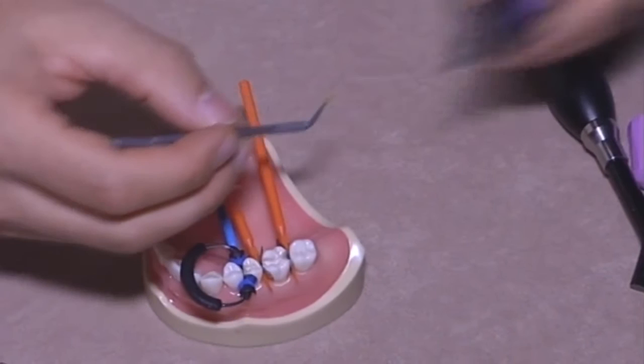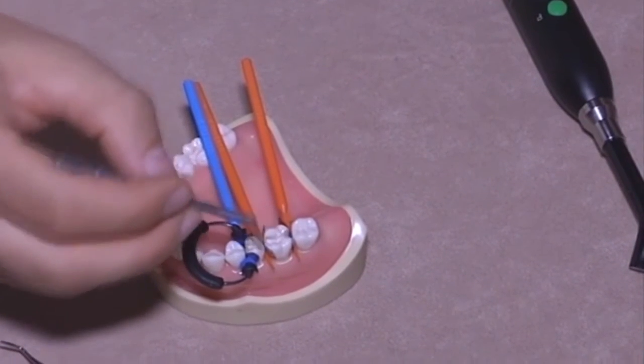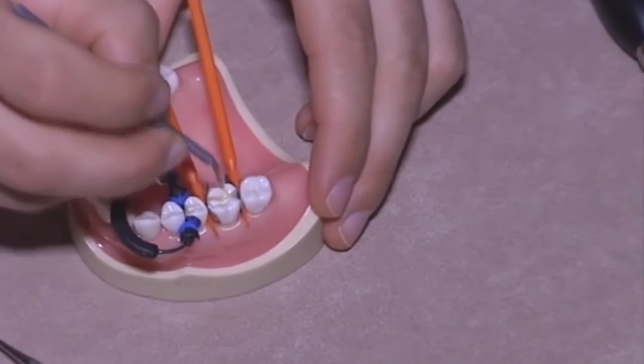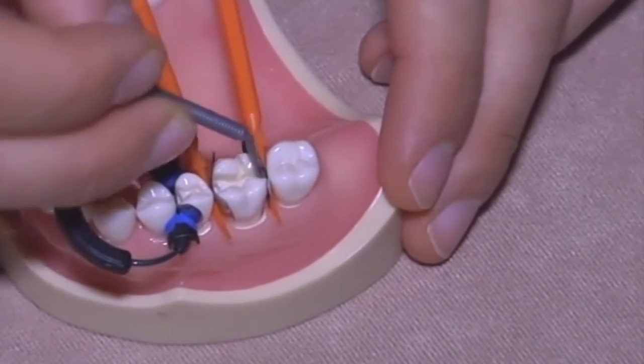Let's get another drop of universal adhesive. Let's imagine we had pre-etching of the enamel, and let's place the bonding resin everywhere again.